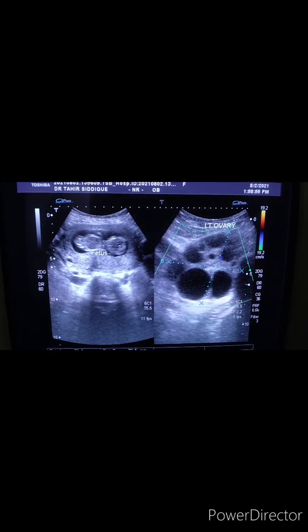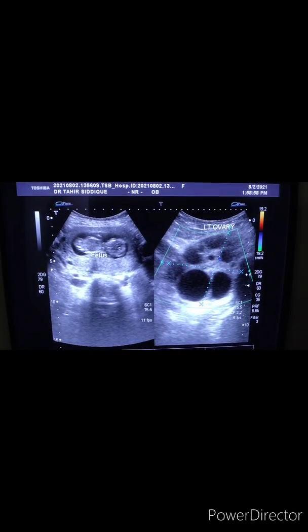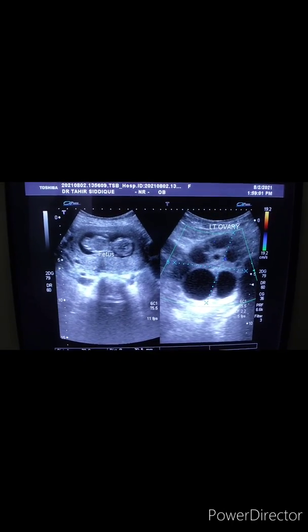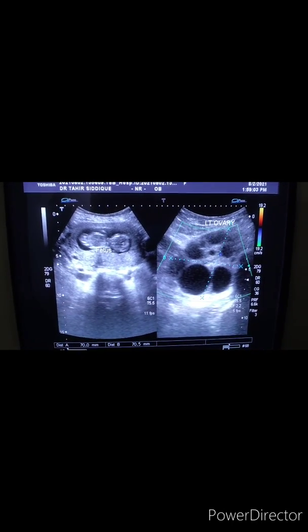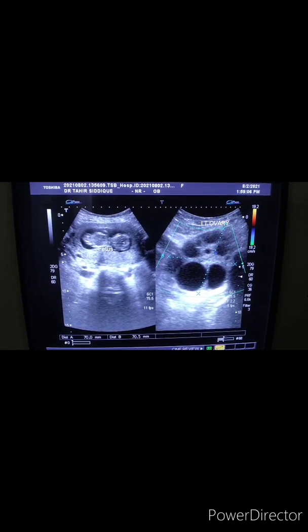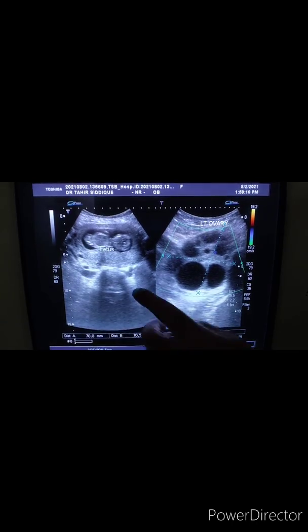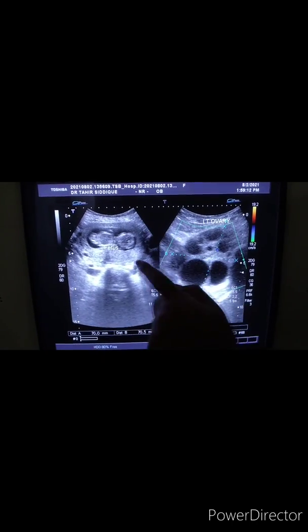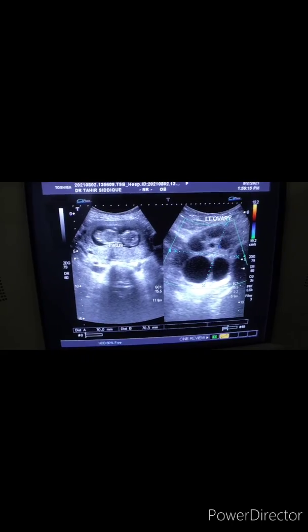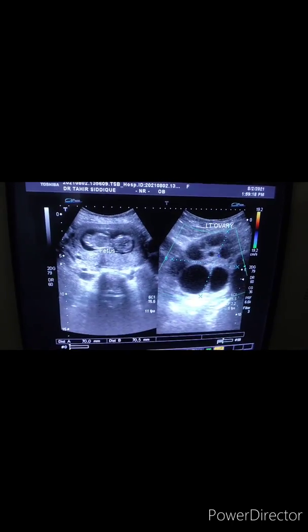Frozen image of an obstetric scan in which the gestational age is 12 weeks. This is the fetus, this is the gestational sac, and the fetus is 12 weeks.